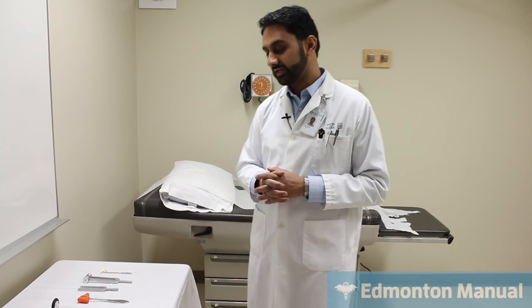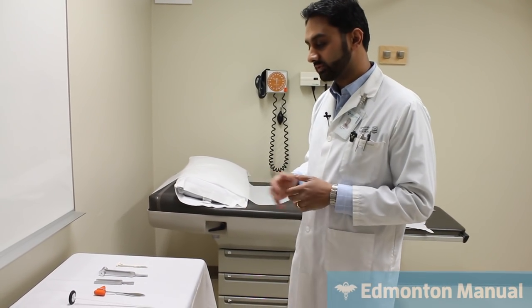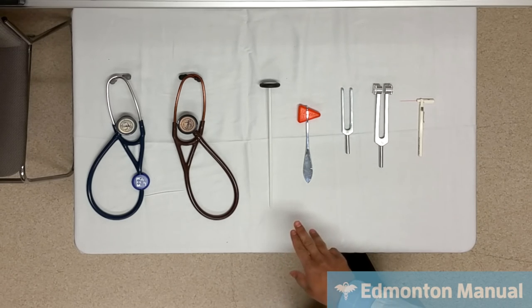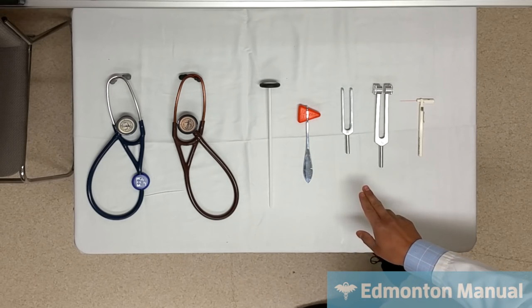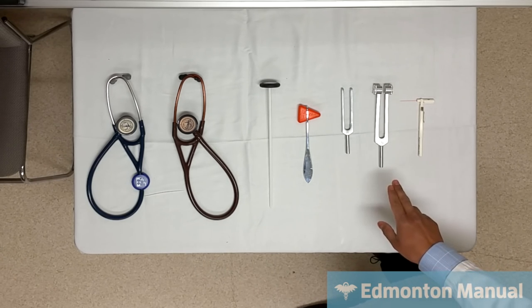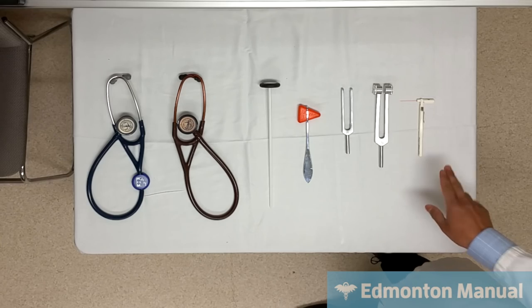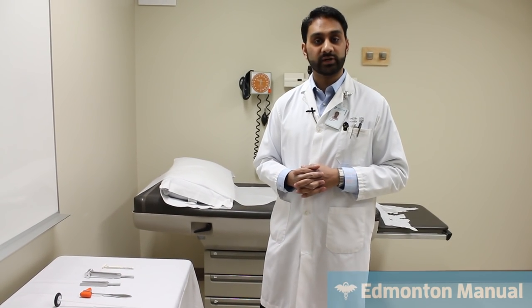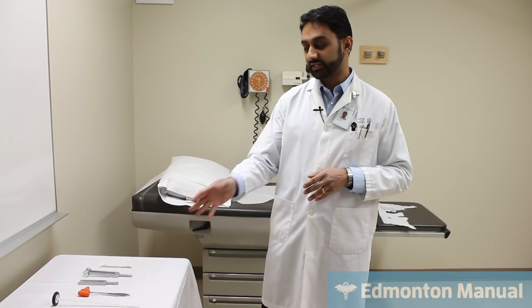So today we're going to be going over some of the common tools that we use in medicine. What we have here on the table is a variety of tools: two stethoscopes that I'll go through, the Queen Square reflex hammer, the Tomahawk reflex hammer, a 512 hertz tuning fork, a 128 hertz tuning fork, and a monofilament. Now there are other things you may use, but these are probably the most commonly used instruments in the physical exam. So we're actually going to start with the stethoscope.